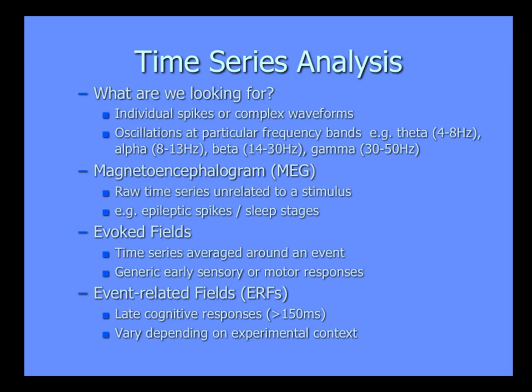If you're looking at individual waveforms or spikes, like I showed you, you can do something just at that. Or what is more interesting these days is really to look at the rhythms of the brain at particular oscillations, like the alpha rhythm that I showed you. But we do a lot of processing in a number of different bands. Each band reflects different aspects of functional connectivity or functional capability in different regions of the brain. And I'll go a little bit into that.